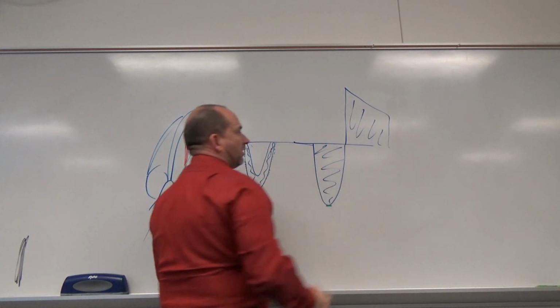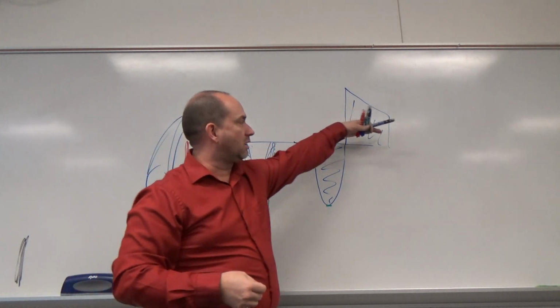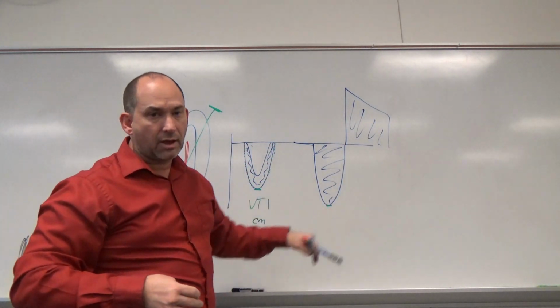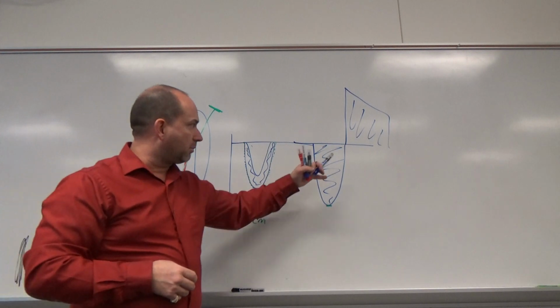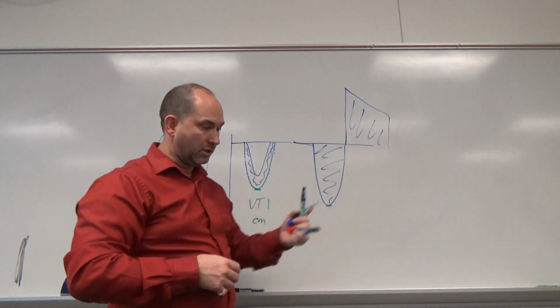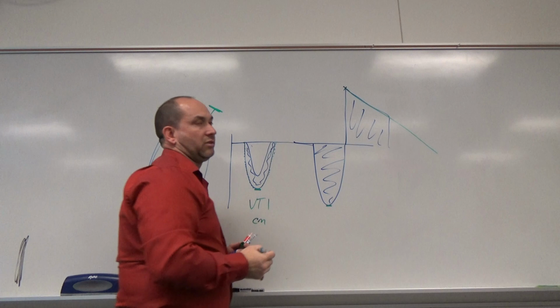There could be regurgitations going on that are going to be above baseline and a lot higher velocity than what our waveform there is. Not concerned about that. We're actually going to kind of cut that off. If it aliases, no big deal. I'm interested in this velocity at this moment. If we do have regurgitation, we're going to go to continuous wave Doppler, which we're in currently, move the baseline down, optimize for this, and we're going to measure the slope of that to the baseline.